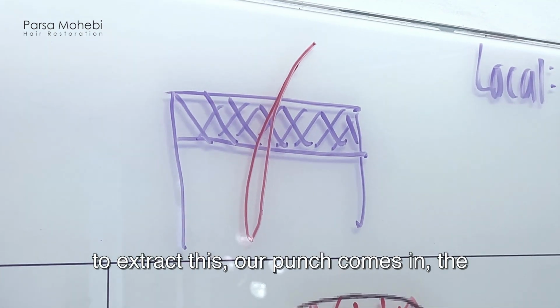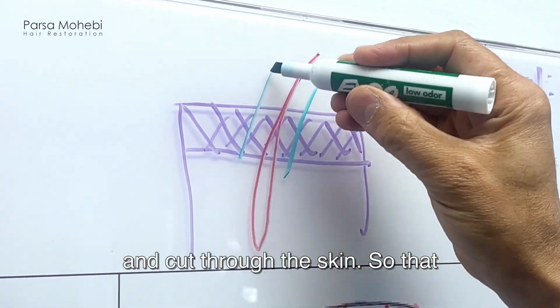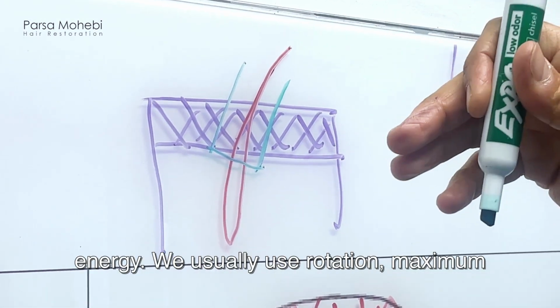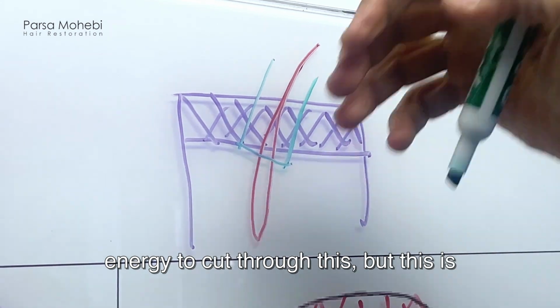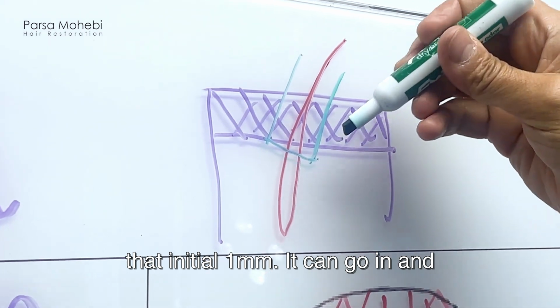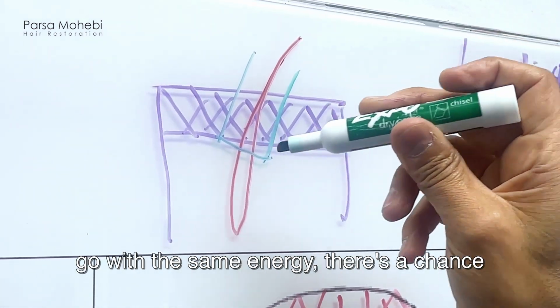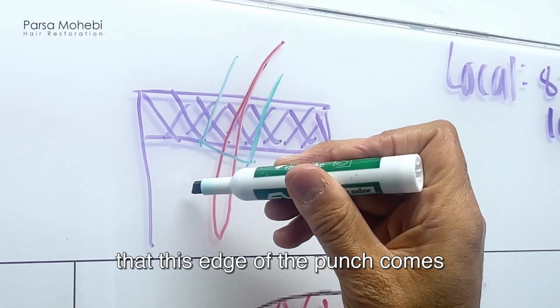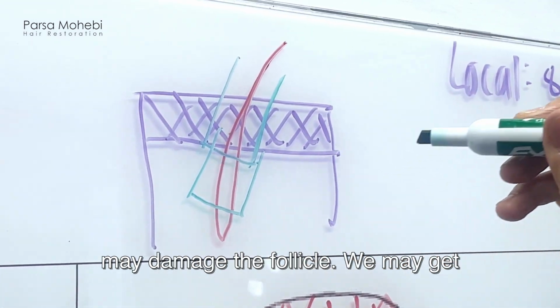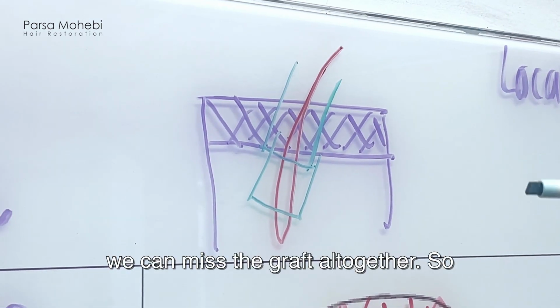So when we want to extract these, our punch comes in, the first phase goes all the way through this and cuts through the skin. That superficial layer of the skin needs more energy. We usually use rotation, maximum energy to cut through this, but this is very superficial, only 1 millimeter. When we pass that initial 1 millimeter, we can go in and out real quick, but still, if we go with the same energy, there is a chance that this edge of the punch comes very close to the hair follicle and we may damage the follicle. We may get transection or pairing of the grafts, or we can miss the graft altogether.